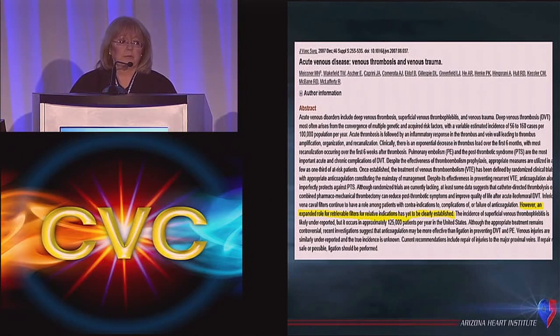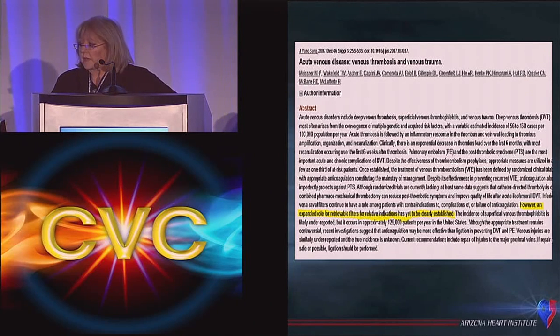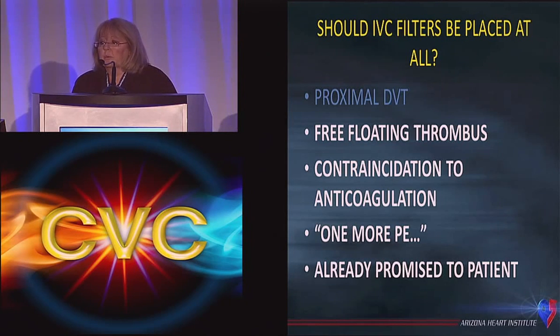Then came all these mechanical thrombectomy catheters. Well, there was an article in 2007 from a group of vascular surgeons, quite renowned, discussing acute DVT therapy, et cetera. And this was published in the Journal of Vascular Surgery. And they concluded that actually there is no data that can determine whether or not we need a temporary filter when using mechanical thrombectomy. It may intuitively seem like a good idea to some people depending on the circumstances, but overall, the incidence of reported PEs associated with lytic therapy and mechanical thrombectomy is really low.